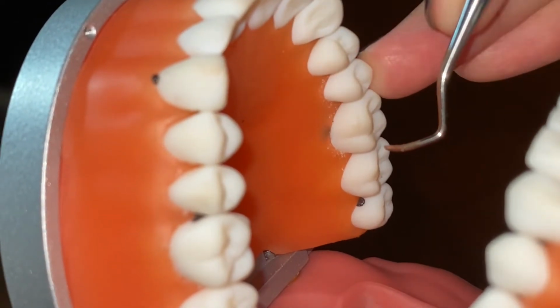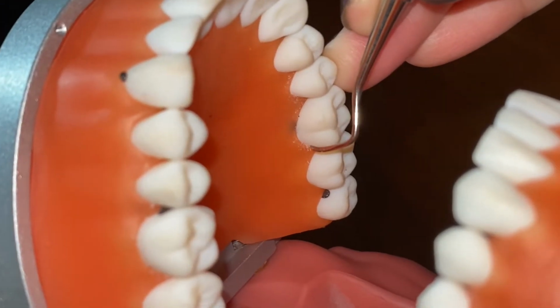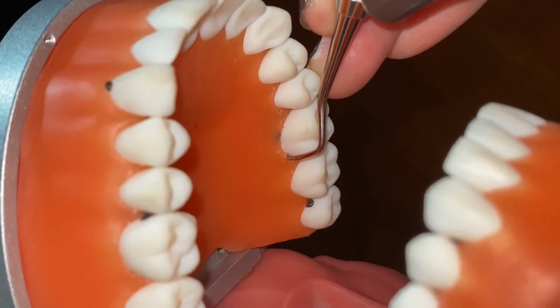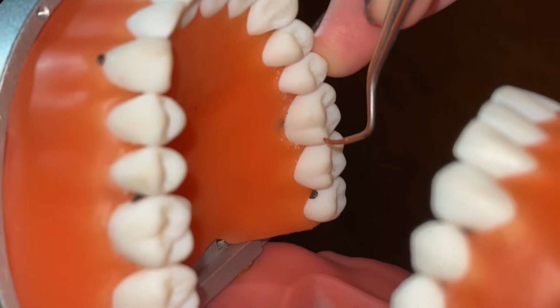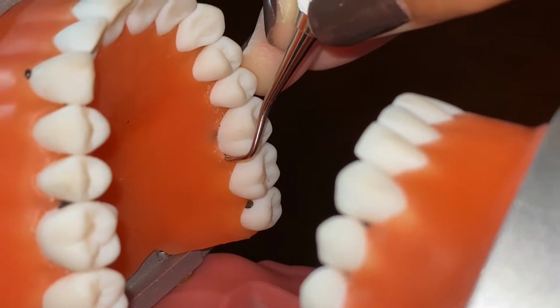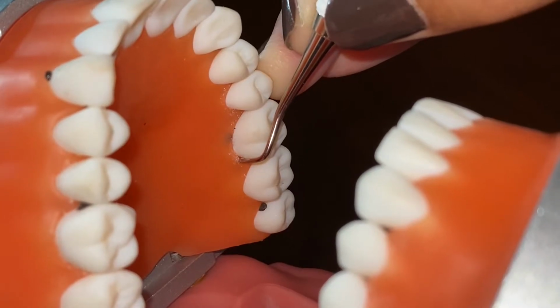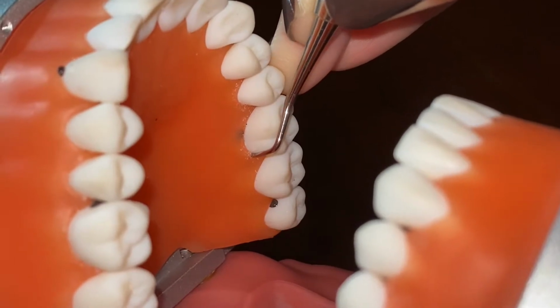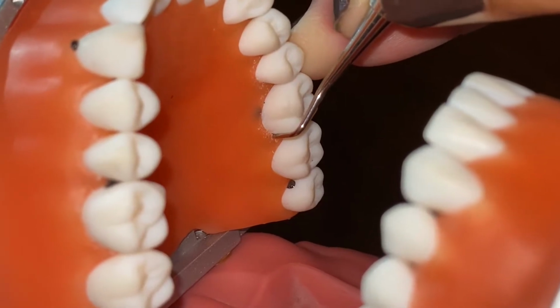So you want to insert your tip at 0 degrees, so that way you're not cutting the gums of your patient. Then you'll want to open your blade up to about 70 to 80 degrees, and then we're going to achieve a scaling motion by just moving your arm up and down. Up, down, up, down, up, down.